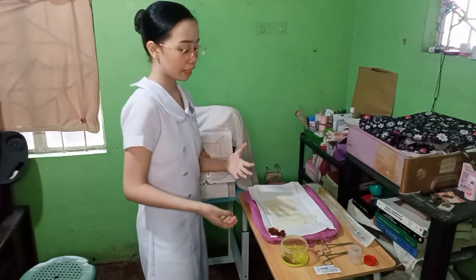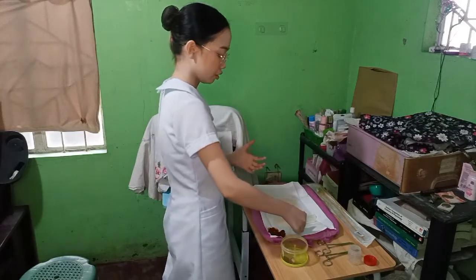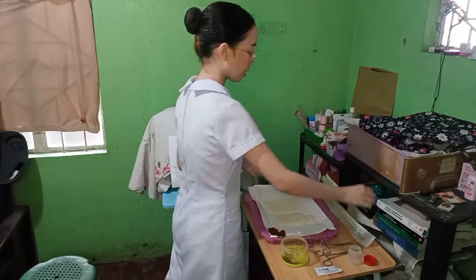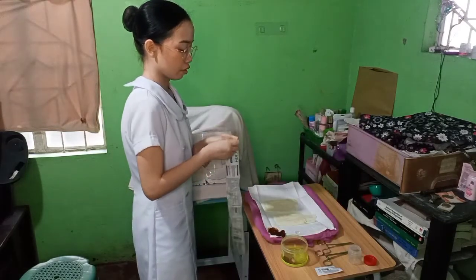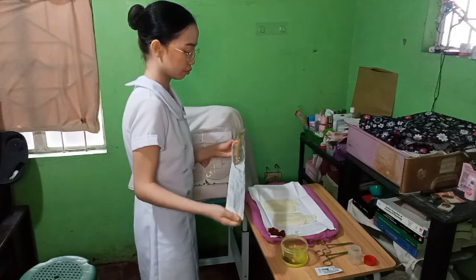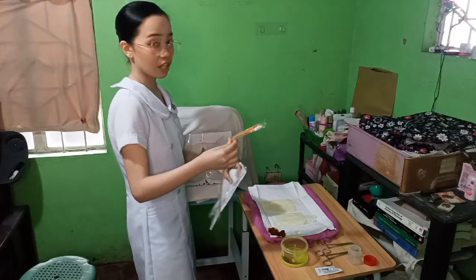And then put an ample amount of water-soluble lubricant in any vacant spot in the sterile field. Then open the catheter and place it also on the sterile field. Using a sterile technique.